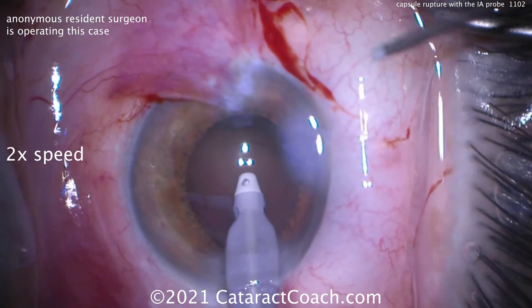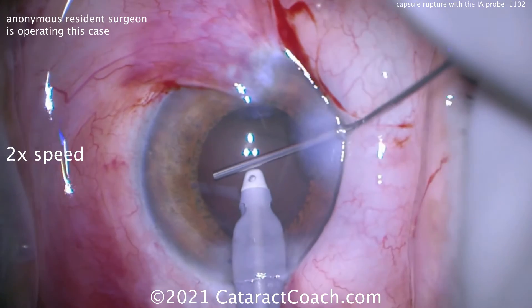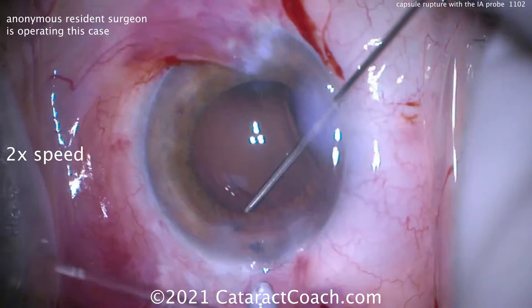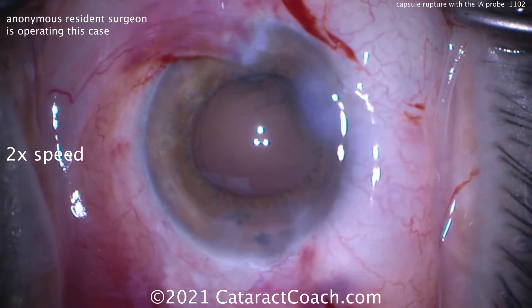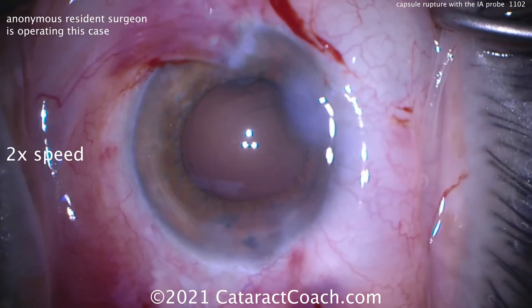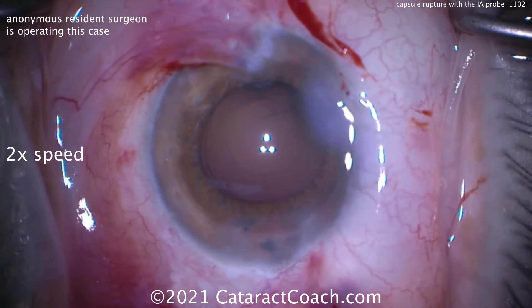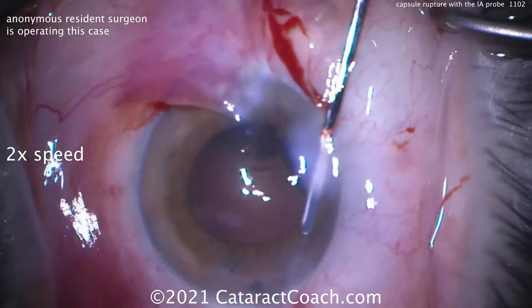The good move is the infusion's still on. Look at the left hand — the infusion is still going inside there. That is important. Now filling up the IA with viscoelastic. Notice how the foot pedal stayed in position one, and just as we started to inject the viscoelastic, then you could go to position zero and inject more viscoelastic and then pull out. There is zero vitreous prolapse in that picture right now. That's the amazing part.